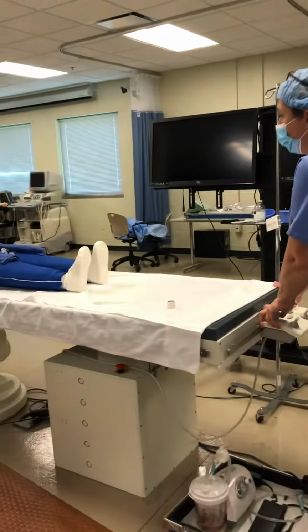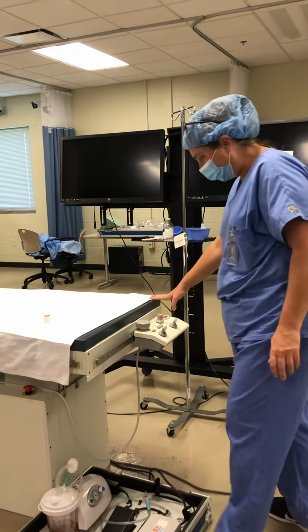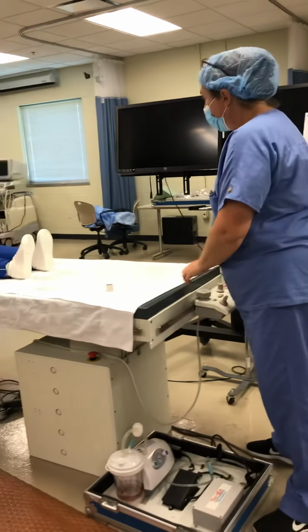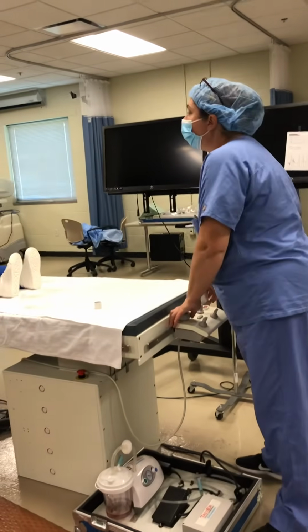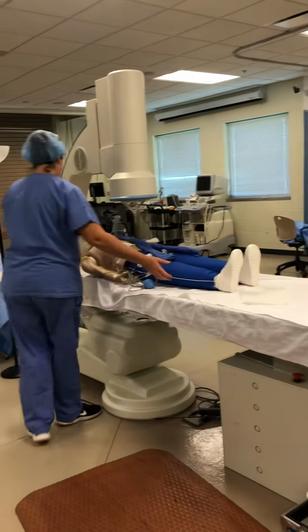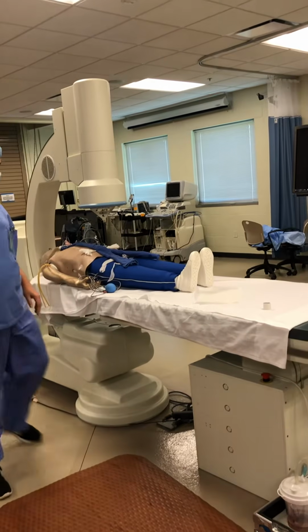All right? The biggest thing is, I moved that the other day to do something. I don't remember what it was. And the patient is a little low on the bed. I'm going to have to get him all the way up right now.